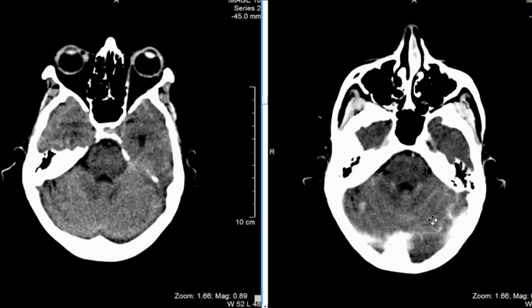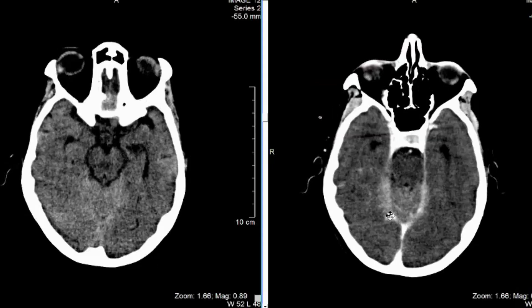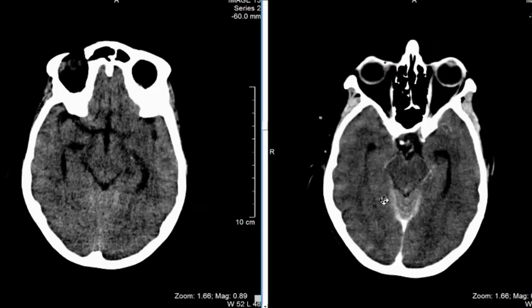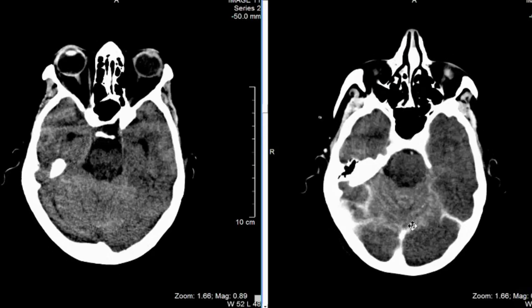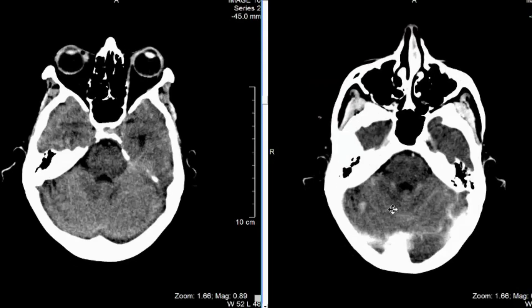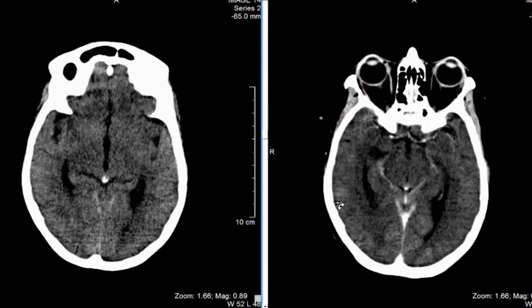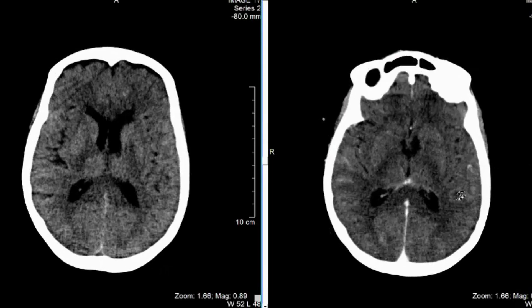But on the post-contrast exam, the abnormalities are quite striking. On this image here in the posterior fossa, the sulci are really enhancing a lot. We see some enhancement — normal enhancement along the dura of the tentorium — maybe even a little increase from normal. But there is lots of enhancement within the sulci throughout the cerebellum. And as we look even higher, there are scattered other areas of enhancement that seem to be within the sulci.